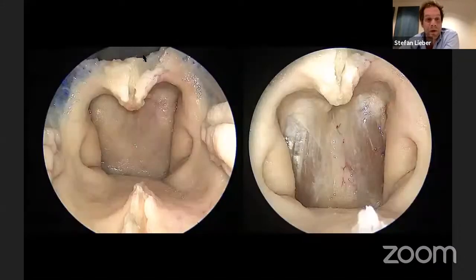This is the mid-clivus now. This is the floor of the rostrum. Again, the vomer has been removed. This is the inferior turbinate, Rosenmüller fossa, torus tubarius, the back of the nasopharynx. This is the first muscle layer, which is the longus capitis and rectus.